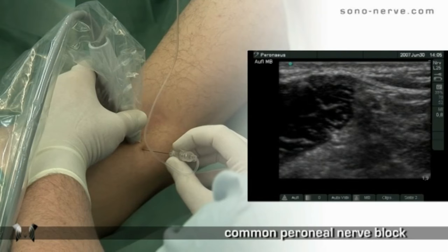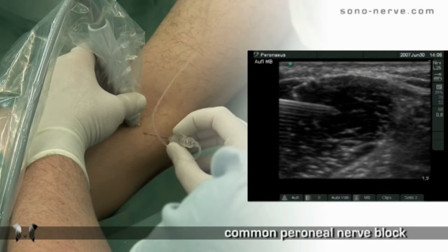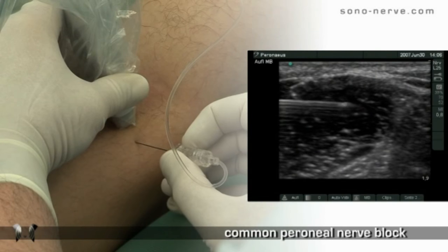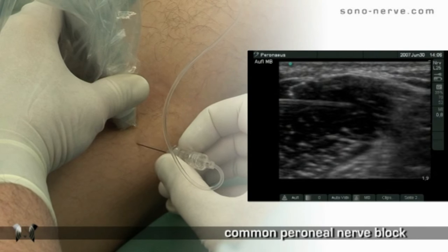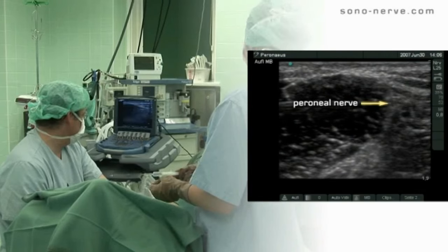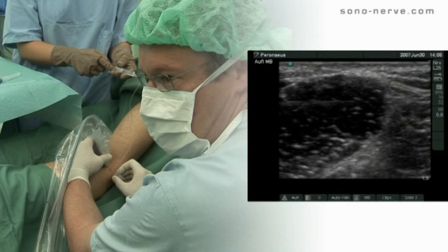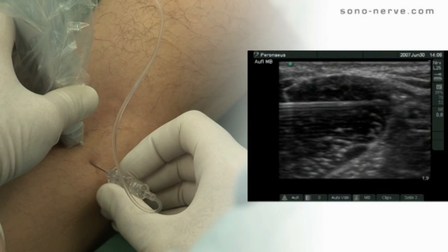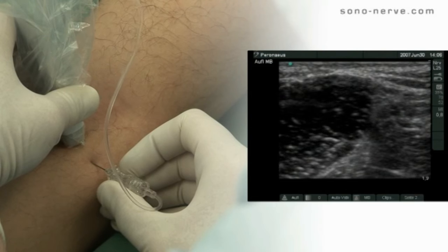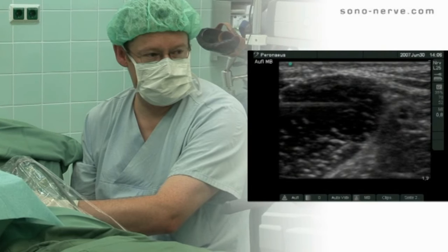Once the operator has identified the target nerve, the needle can then be inserted. Using an in-plane technique as demonstrated in this video clip, the needle passes through the long head of the biceps femoris muscle. Seen very clearly in this ultrasound video clip is the typical reverberation artifact behind the needle. The common peroneal nerve is typical for a peripheral nerve and is highly hyperechogenic.